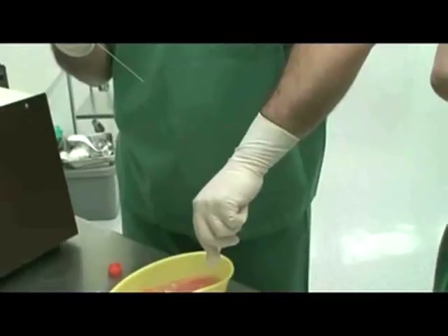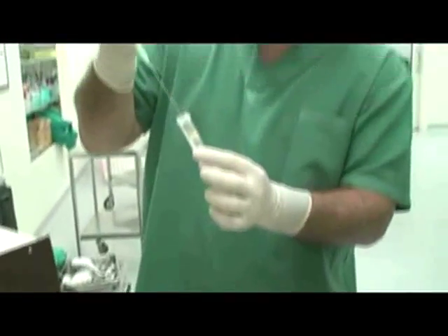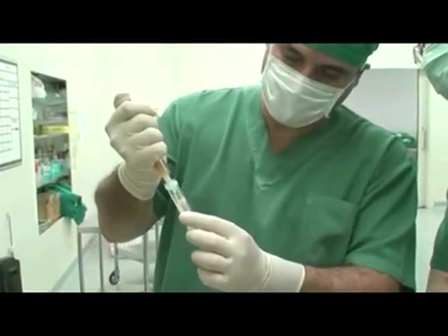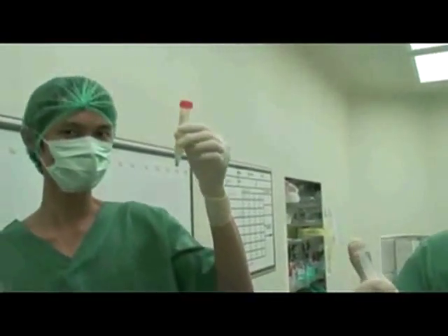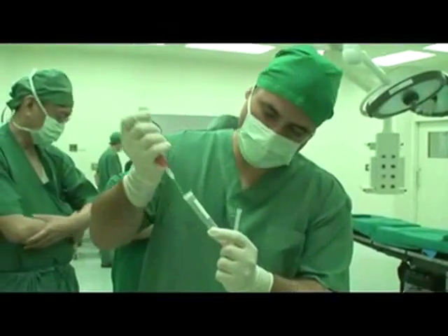After the final spin, discard the clear liquid at the top. Combine the cells at the bottom with PRP from the previous step in a 20 cc syringe and activate for 15 minutes in the ADDI-STEM LED. Please refer to the ADDI-STEM protocol for the exact process.